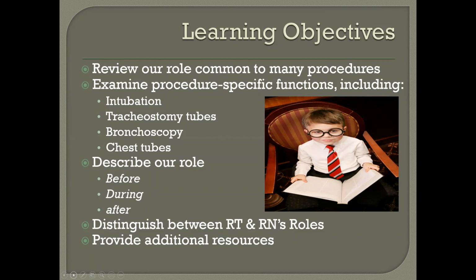One example I can give you is when we're facilitating a bronchoscopy and the patient is not mechanically ventilated and not in the ICU. They may be going to the endoscopy suite, walking and talking. If we're giving them sedation, the sedation via IV should not be pushed by a respiratory therapist.